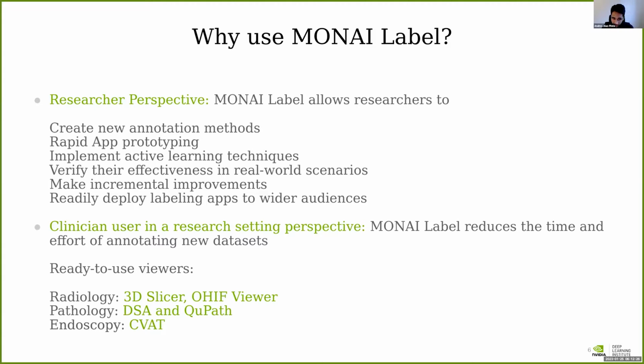The other type of persona is the clinician working in a research setting environment. The only thing that he or she cares about is reducing the time and money for annotating data sets, right? So they want to use the pre-trained model, run inference, see how the model is working, and segment the different organs or tissues, right? And for that, again, we have developed different plugins: radiology, pathology, and endoscopy.